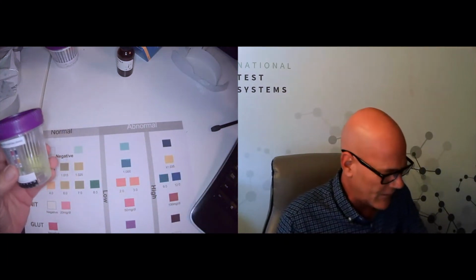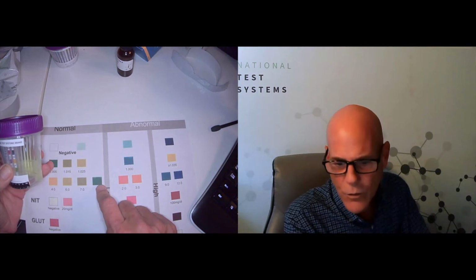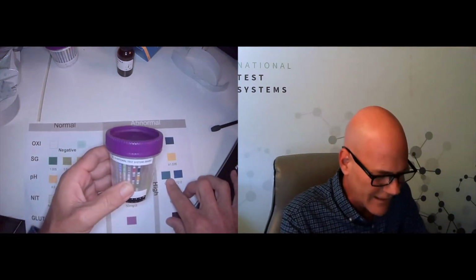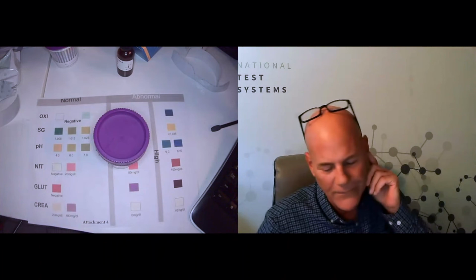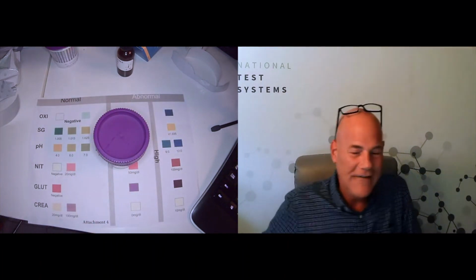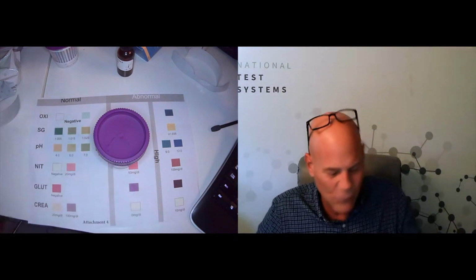And then lastly, we've got the pH level. pH looking pretty green here. Looks near an 8 to me. According to the controls, it should be a 9 or greater. So if we had probably let this saturate correctly instead of me trying to not keep you guys here forever, we would have had a proper color on that one. So again, it's not perfect. Even me sitting here demonstrating it for you, it's a little hard to tell. You can't quite tell if it's one thing or the other.